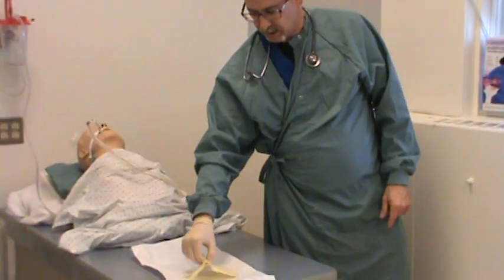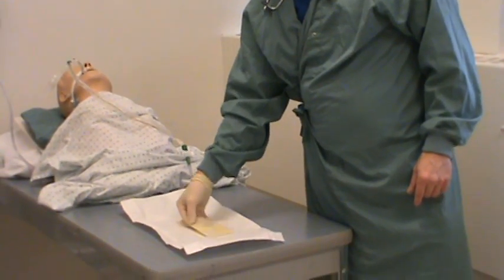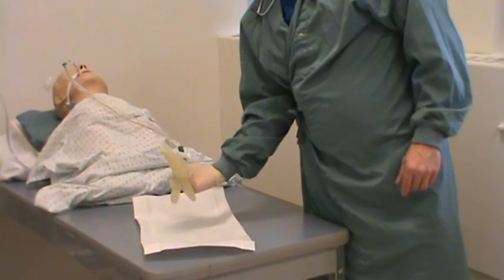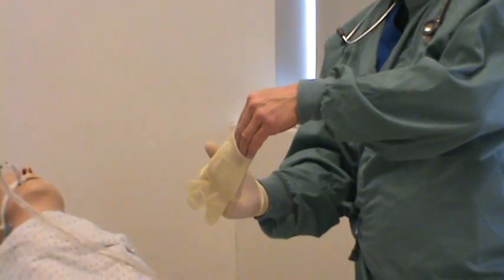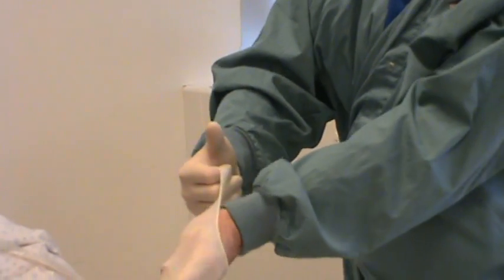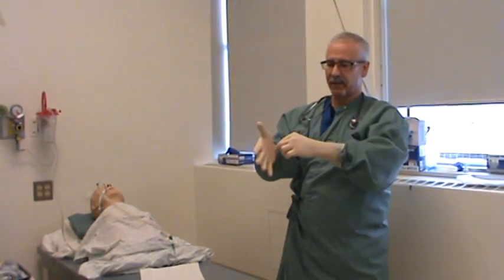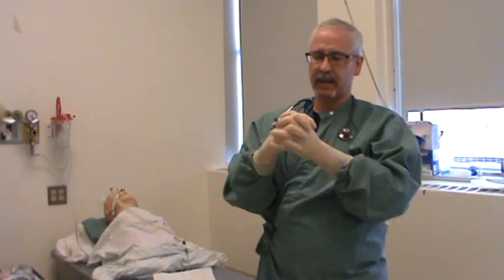The next thing I'm going to do is take my gloved hand, grab this glove — this is the left-handed glove — and put my fingers underneath like so. I'm going to take my other hand and slide it on and into the glove like that. If I wanted to, I could take my finger like so and adjust it up like that. There — I've got my sterile gloves on.